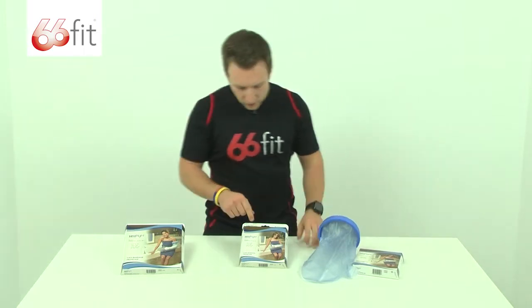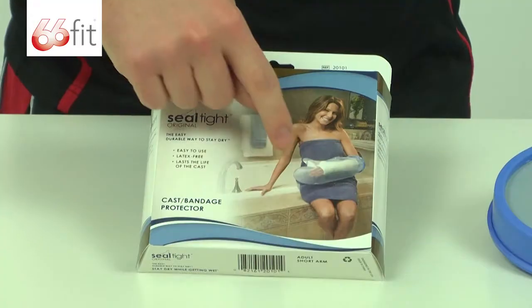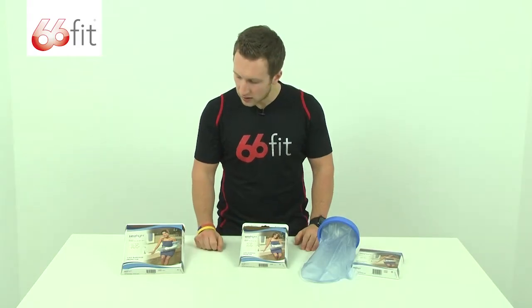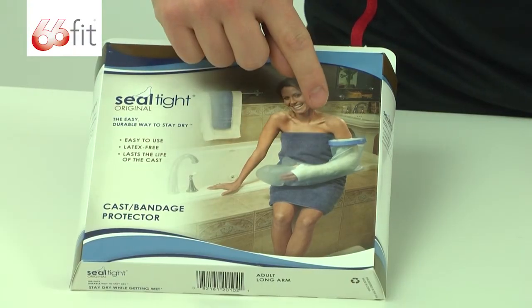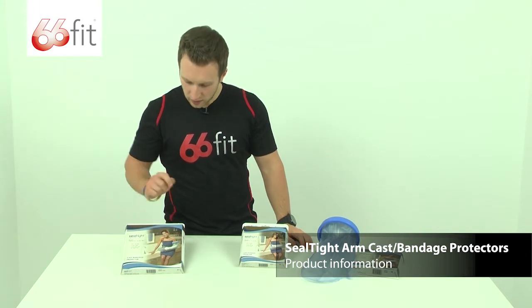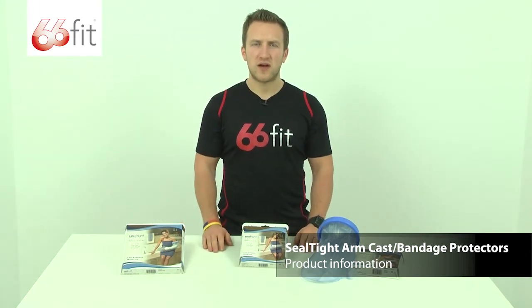Then you move on to the short arm, which is 23 inches in length, so it is going to come slightly further up towards your elbow, like you can see in the picture here on the front. And then the final one is the long arm, which is going to come all the way up past your elbow and two thirds of the way up your bicep, and that is 40 inches. All of these products are for adult use.